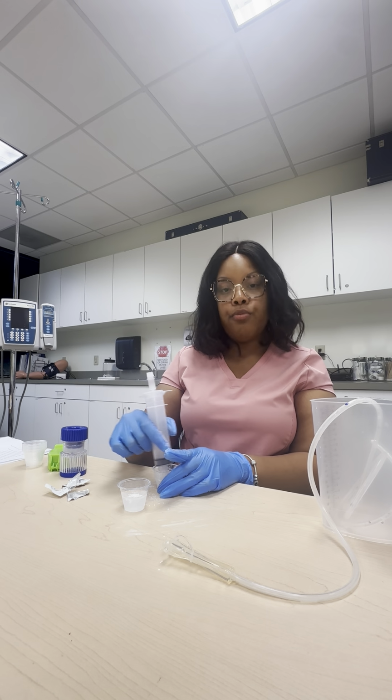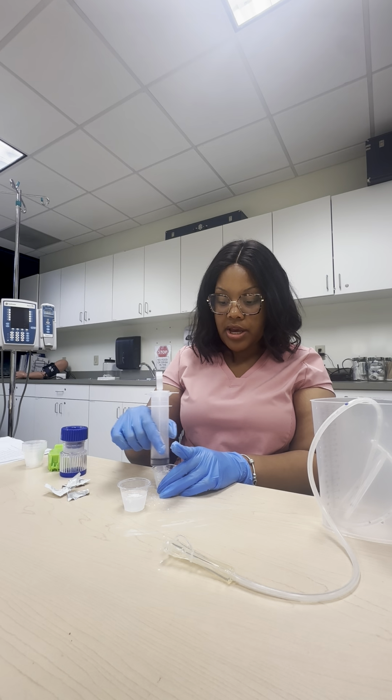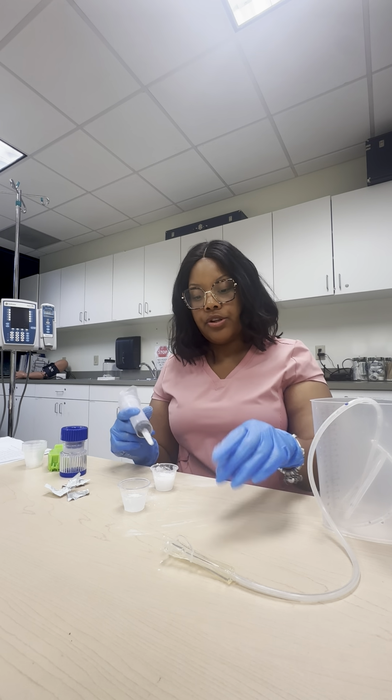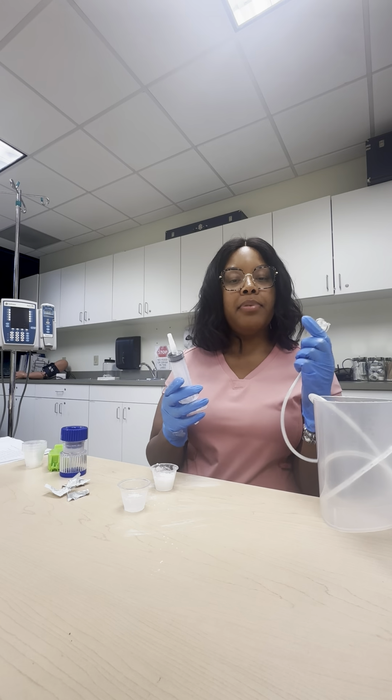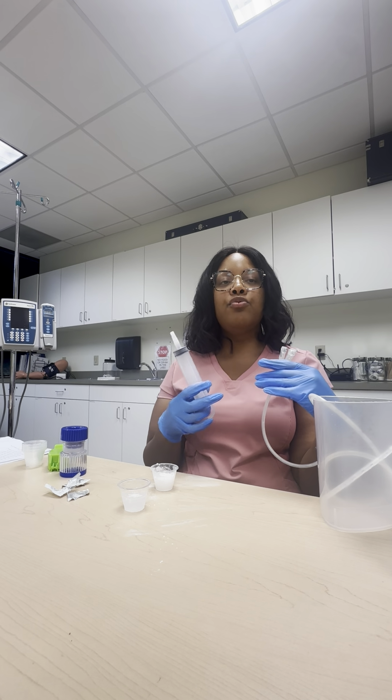So in real life, you want your medication to dissolve as much as you can, but with these demo medications, sometimes they just don't dissolve like that. All right, so we then go to our peg. If our patient is hooked up to continuous feeds, we will pause it.